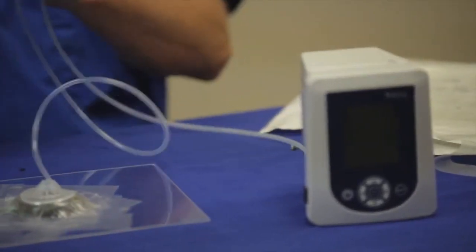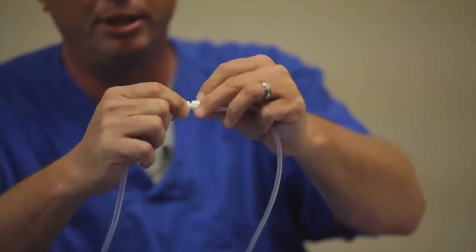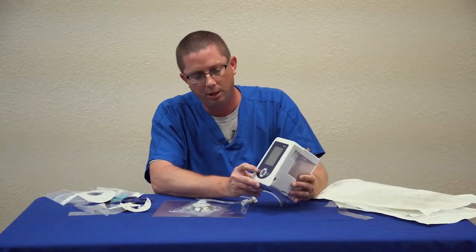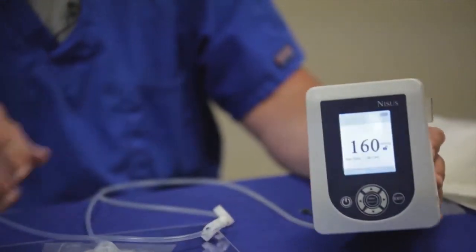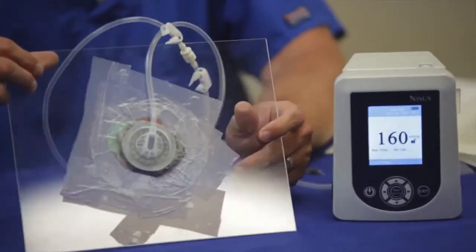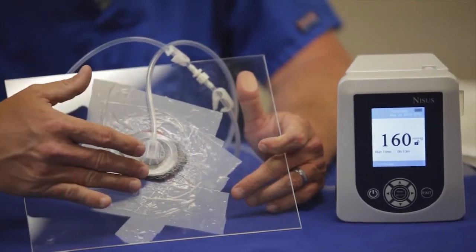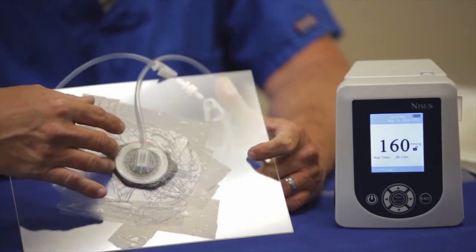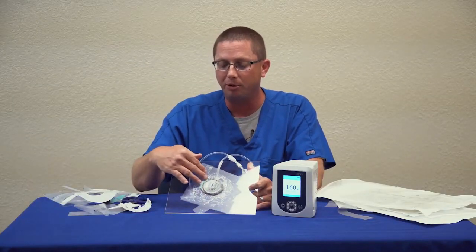Ensure both clamps are unclamped. Connect the luer lock device by twisting, do not over tighten. Power on your negative pressure device. And as you can see, it's raisin-like in appearance. It is pulled down. You should be listening for hisses, air leaks around the dressing. You can feel them at times. You can also use your stethoscope to listen for them.